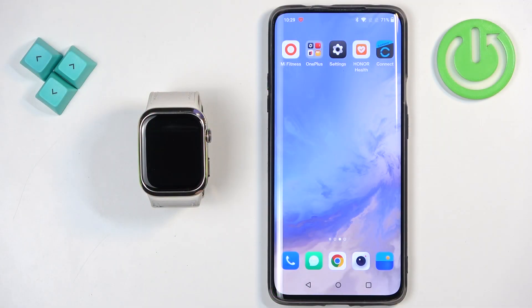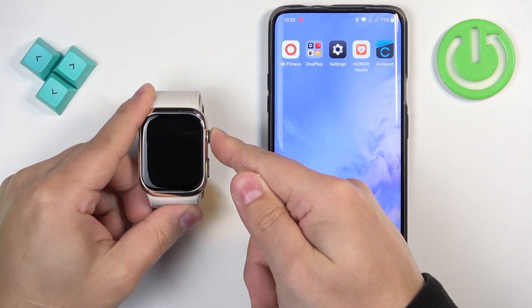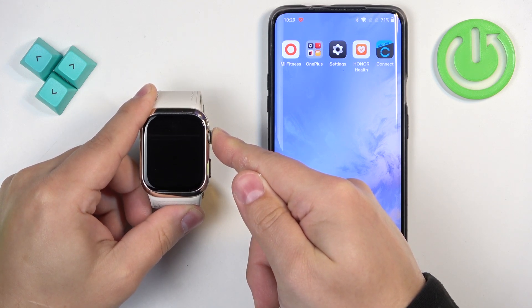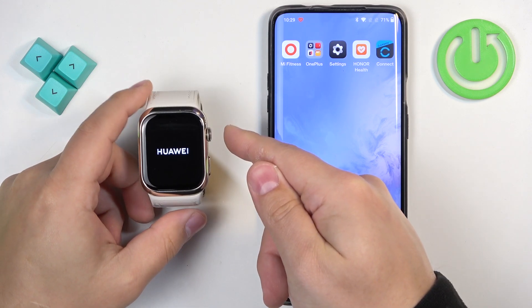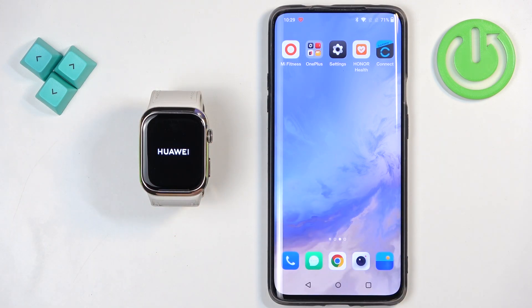First thing we need to do is turn on our watch, and you can do it by pressing and holding the crown button. Keep holding it until you see the Huawei logo on the screen. Once you see the logo you can release the button and wait until the watch is done booting up.